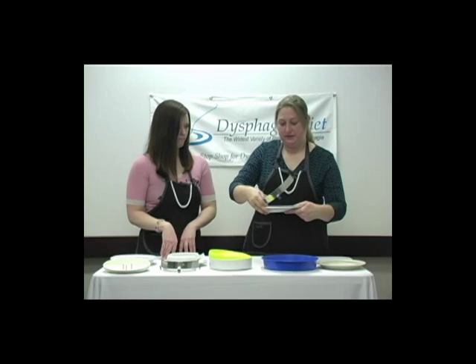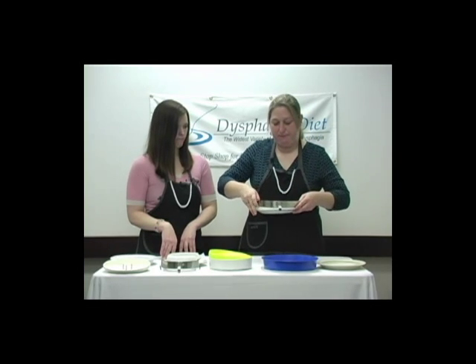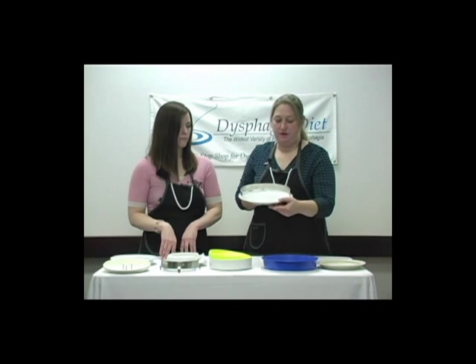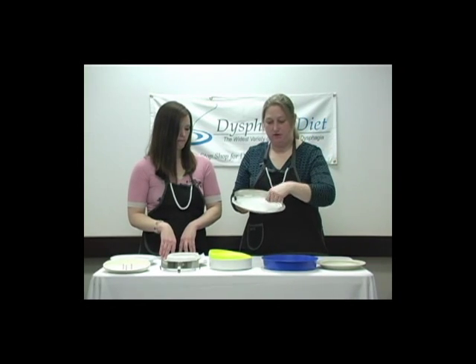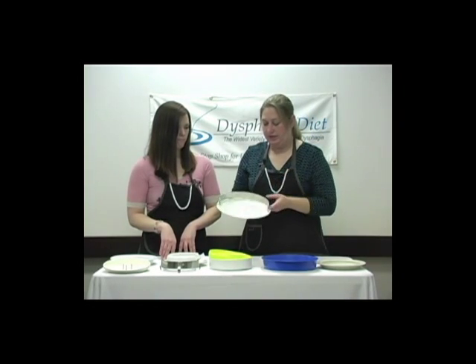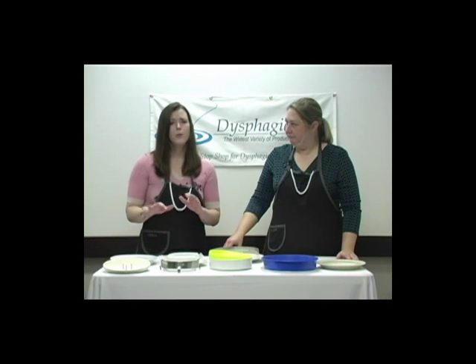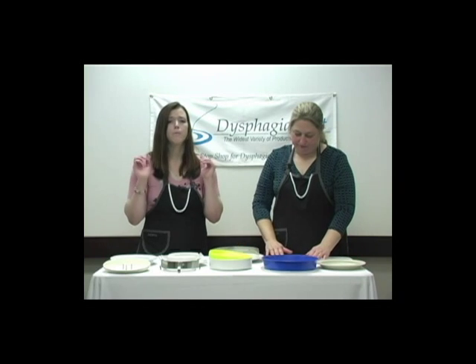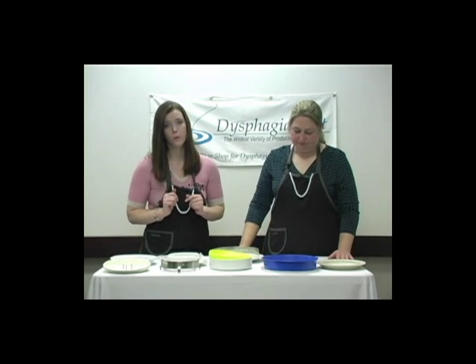And once you have the right size plate guard, just pop it on the edge with the tabs, the metal tabs here, and you have an easy plate guard that'll help you scoop your food out easily with a fork or a spoon. You don't have to worry if you've got plates that have, say, a fancy edge or anything like that. As long as they're basically round, the plate guards will work.